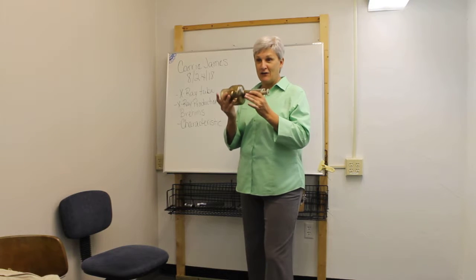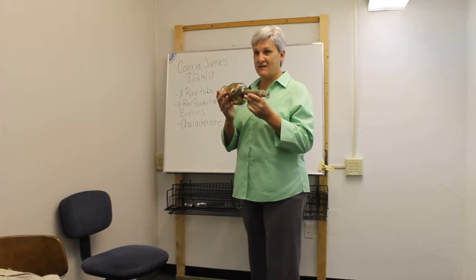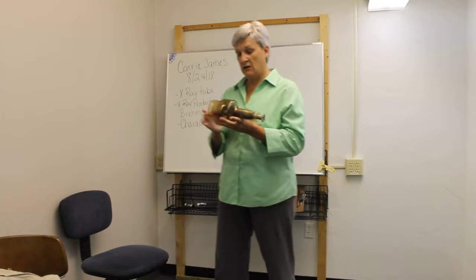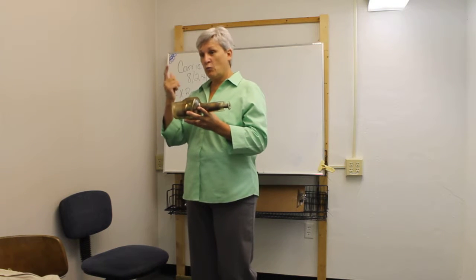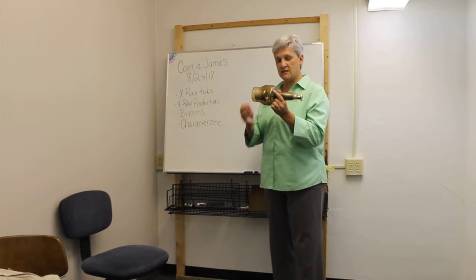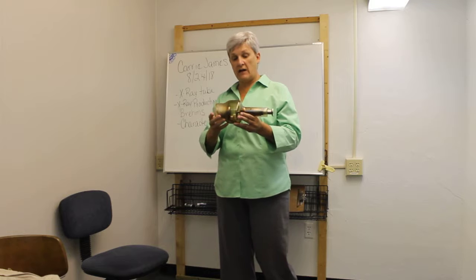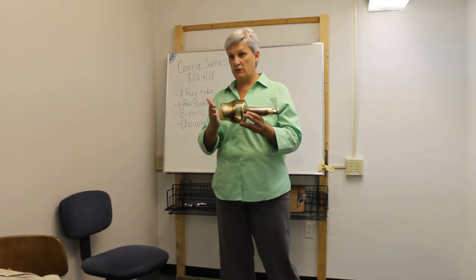Well, the benefits outweigh the ineffectiveness of this, because when we're producing X-ray, only 1% of what we're doing is actually an X-ray. The rest of it's heat. 99% of this production is heat. And if you look, we have two ends of it. We have the anode end and the cathode end.